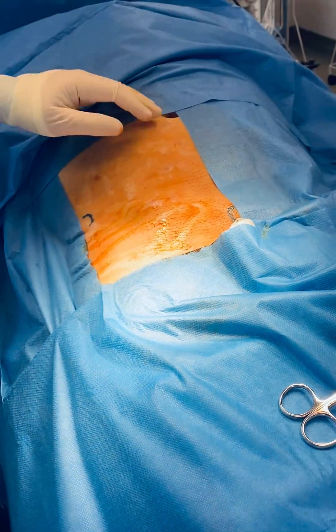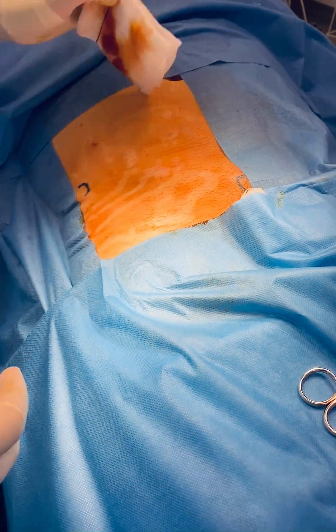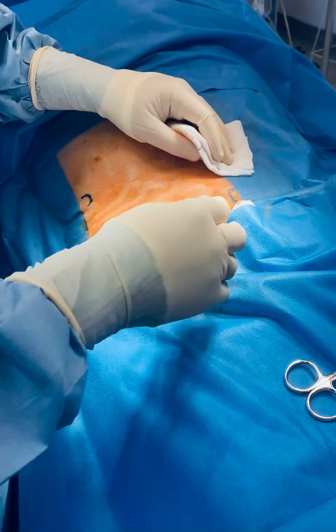We've used 1% xylocaine with adrenaline and 0.5% Marcaine — 20ml of each.